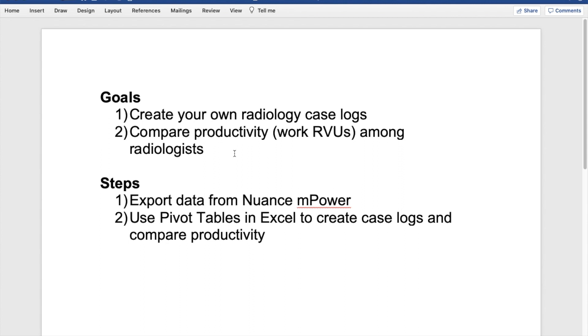In order to do this, you need to do two steps. The first thing is to export data from Nuance mPower, and the second step is to use pivot tables in Excel to create case logs and compare productivity.